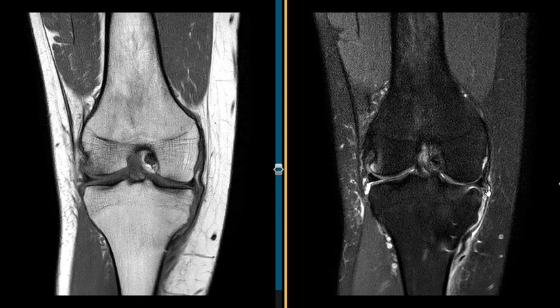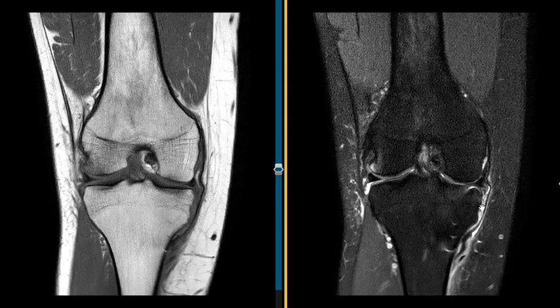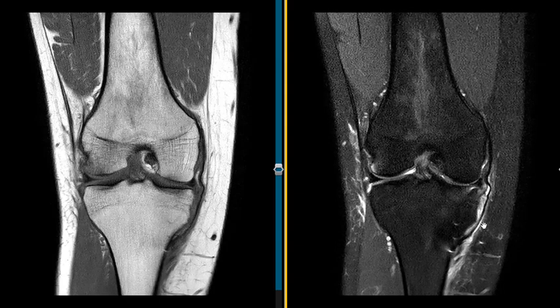On this one, we see the fluid signal really stand out. The marrow is dark and the medial collateral ligament is dark, and we see that there is granulation tissue or edema here between. So this is a periosteal injury where the medial collateral ligament, where it attaches, it's stripped off, and it has reparative tissue here, some probably granulation tissue or maybe even blood products there, and the medial collateral ligament is uplifted, and again it is lax. So this MCL is significantly injured, not doing its job.